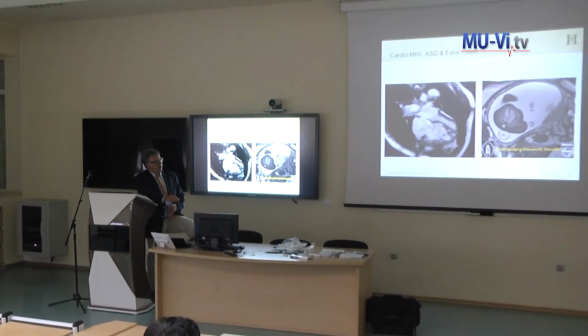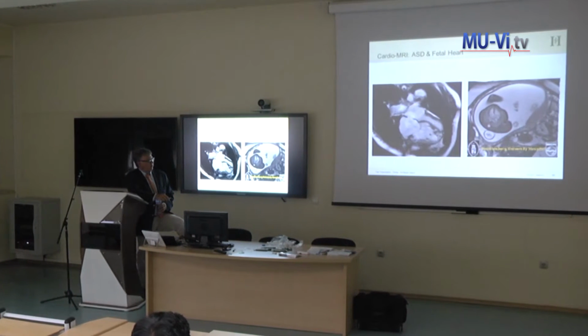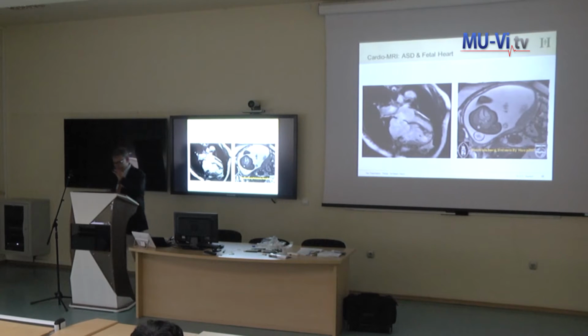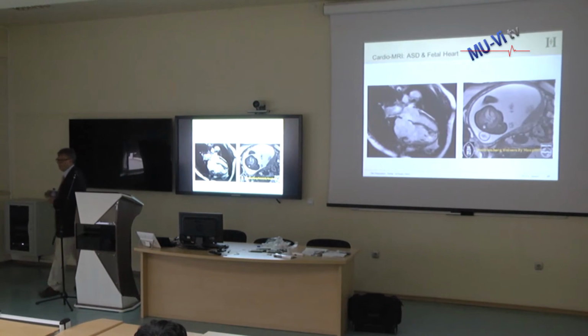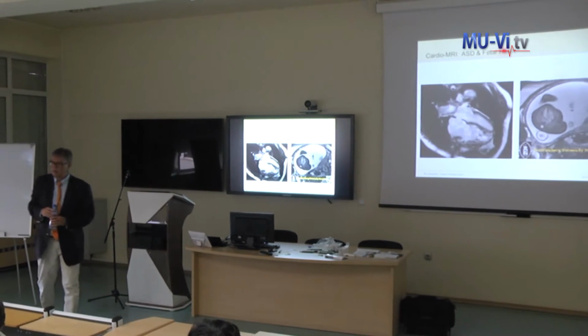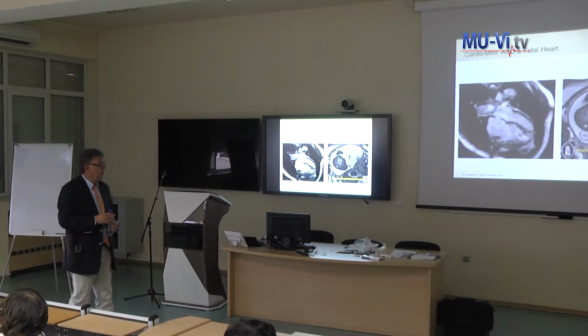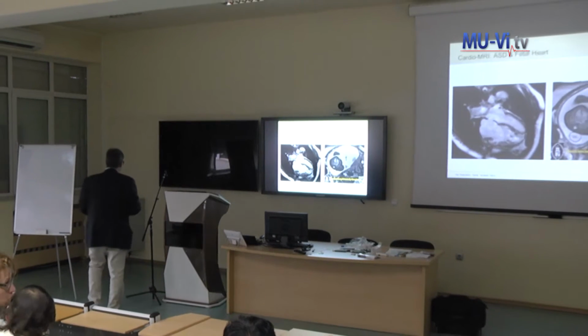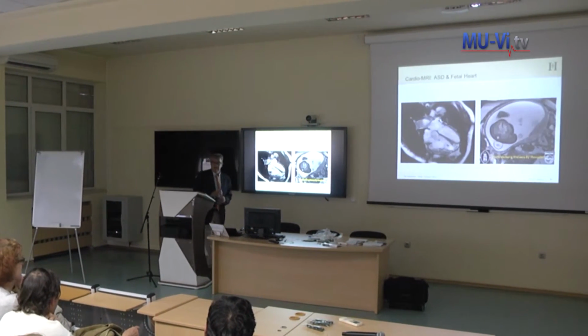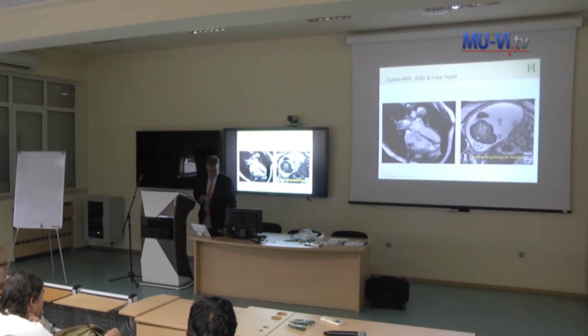And this, I got it from someone, I don't know who. That's a fetal heart. Nobody would make an MRI of a pregnant woman. I don't know why they did that, but this is a fetal heart. It works, and this woman is pregnant. It's a classic contraindication to make an MRI with a pregnant woman.